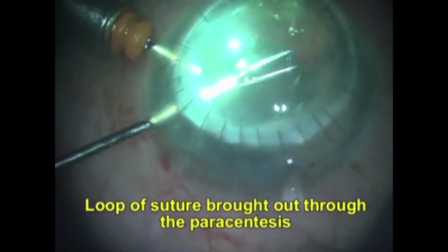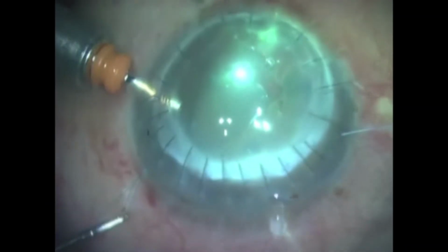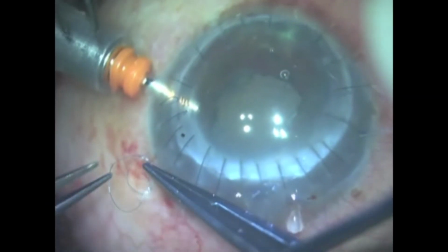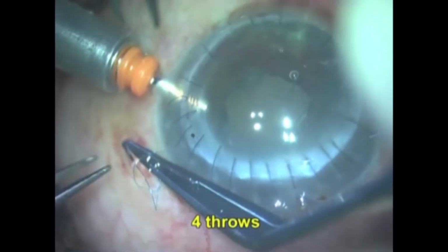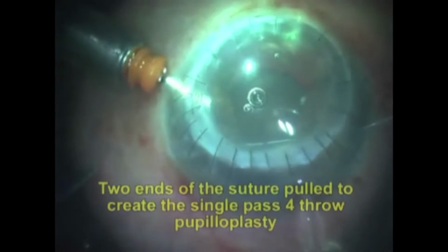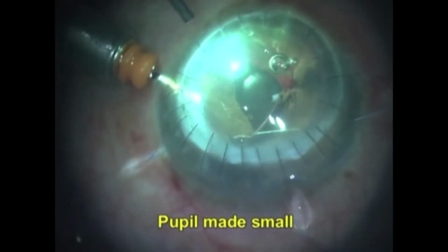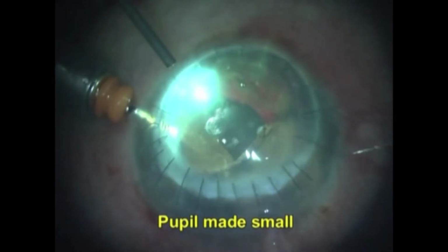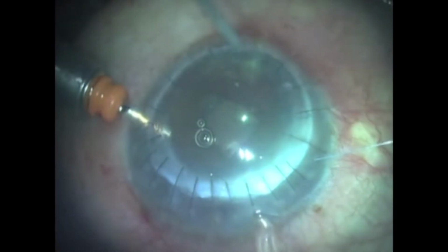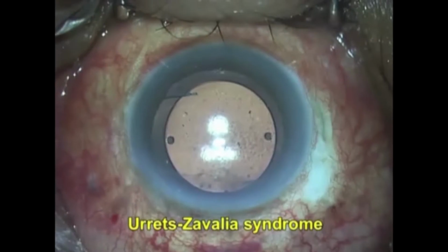A single pass is created and the loop brought out through the paracentesis. Subsequently, 4 throws are done, sealing the pupilloplasty. A 4-point or 6-point traction can be done depending on the nomogram. The basic principle here is simple. Pre-op and post-op, the angle has to be opened and the intraocular pressure reduced.